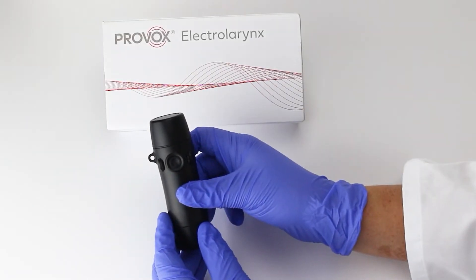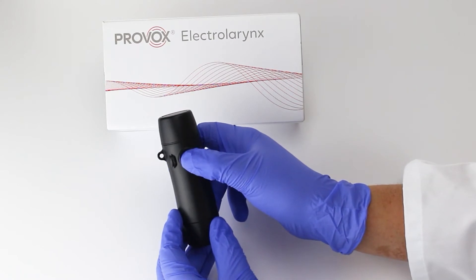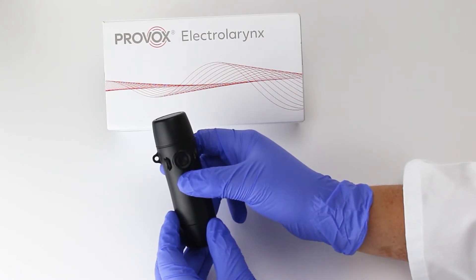If your Provox True Tone Emote or True Tone Plus is experiencing low volume issues, the cause may be a low battery. The device is designed to decrease the volume to prolong battery life.